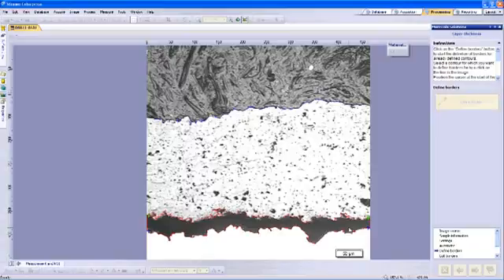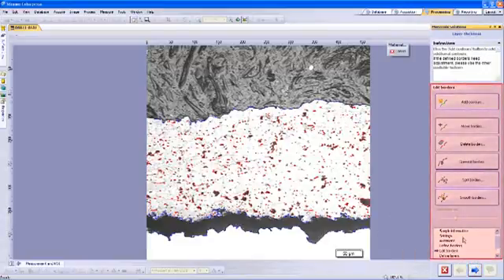Once we have completed the definition of the borders, we right-click to finish. Click the next arrow to edit borders. Within Edit Borders, we can add more contours, move borders, delete borders, connect borders, split borders, and smooth borders. These functions allow you to provide touch-ups needed before taking your final measurements.